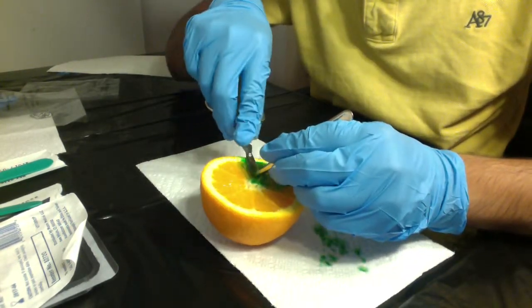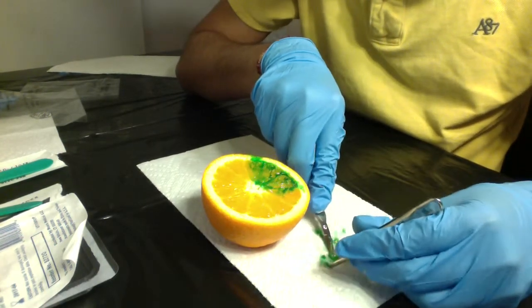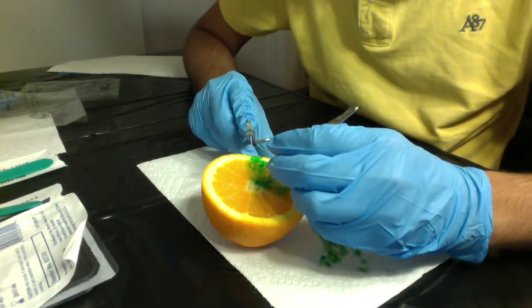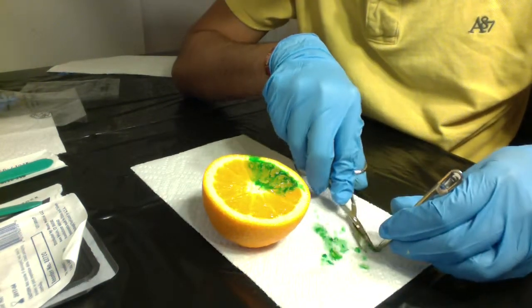I'm keeping my hands fairly stable on the surface, just using the scissors and scalpel as much as needed, and making sure I'm not going too deep. Just pick up the tissues and cut through it using the scissors.